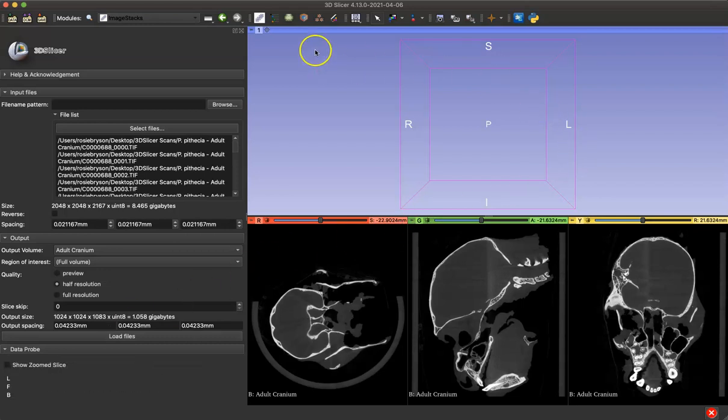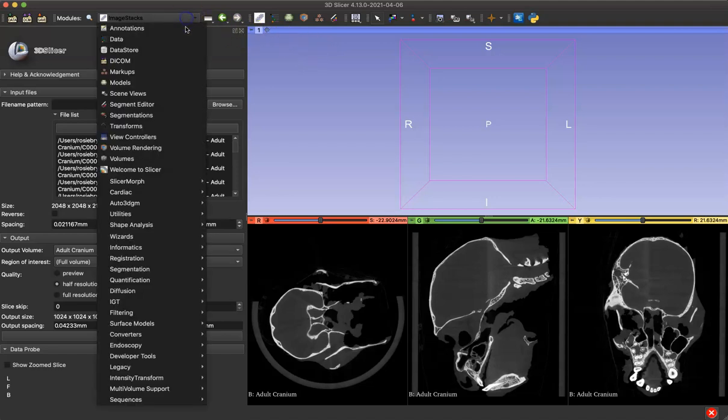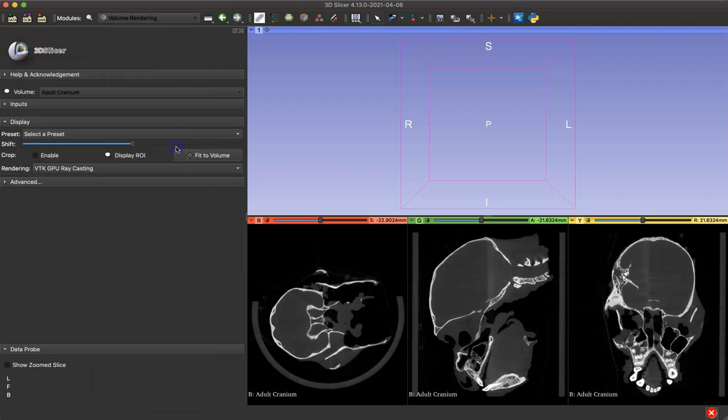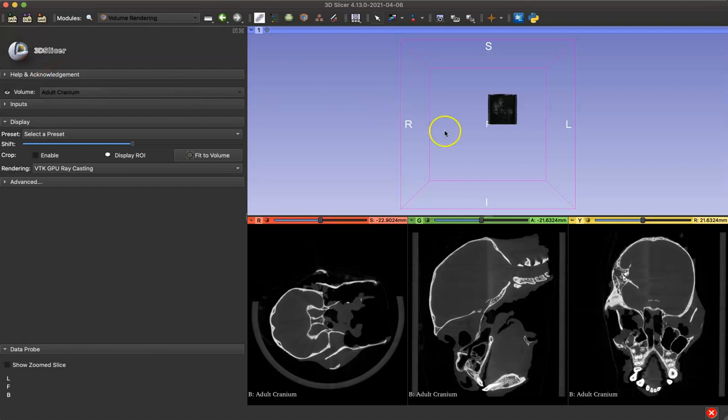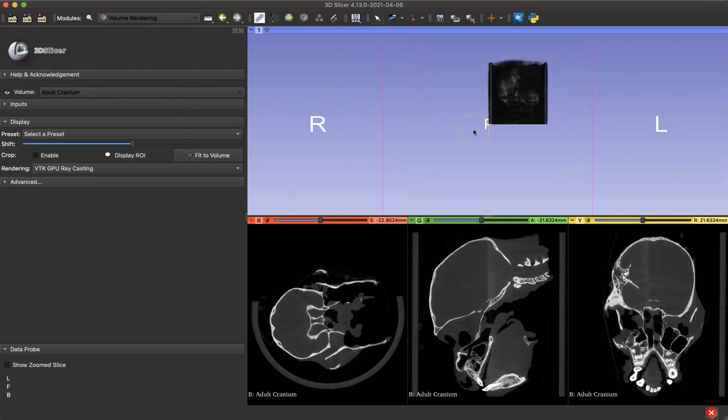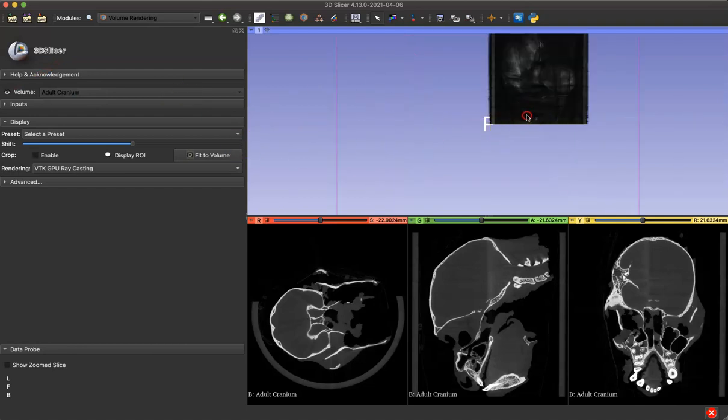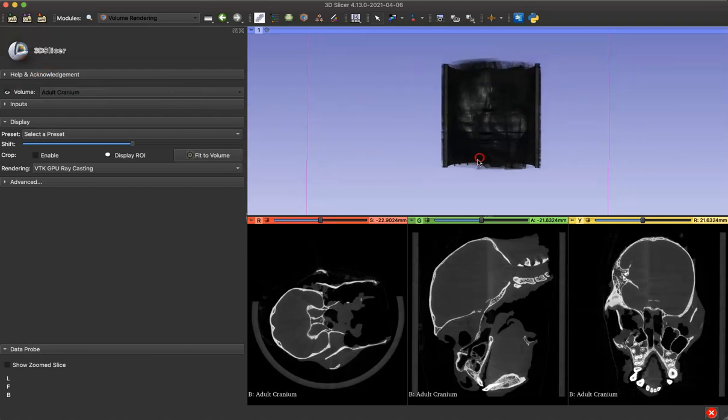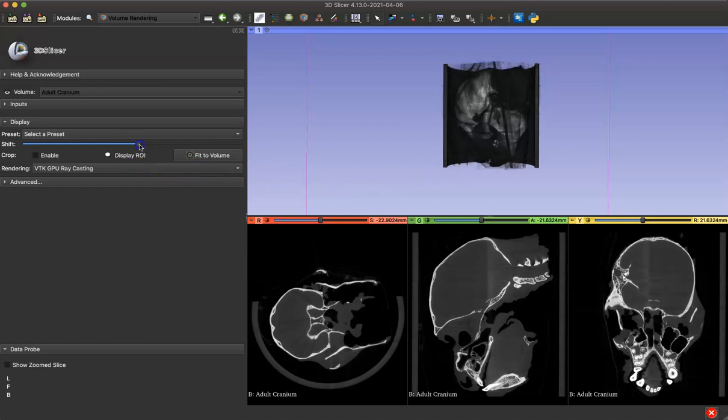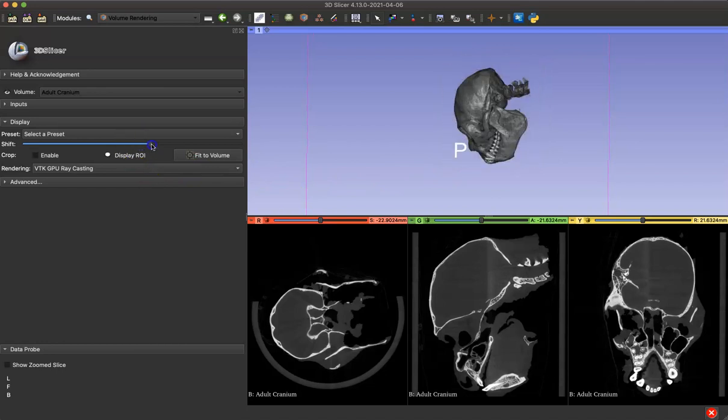So let's quickly visualize this specimen by going to the Volume Rendering module, toggle on the visibility, centering our volume, and adjusting the shift bar until we can see our specimen.